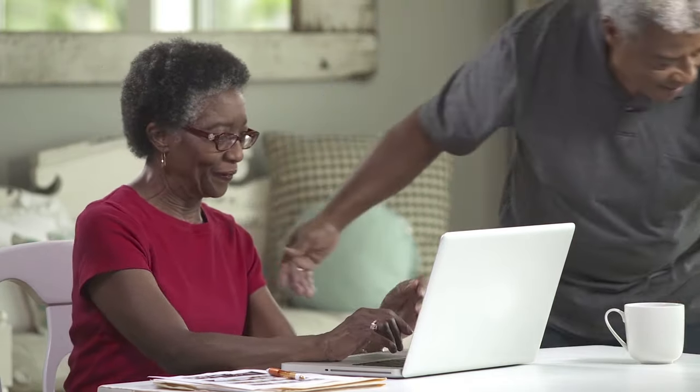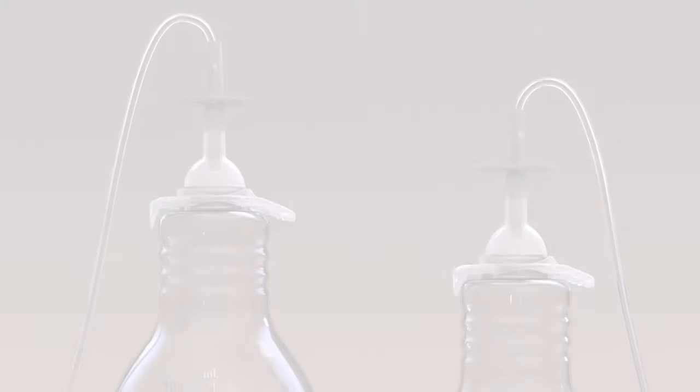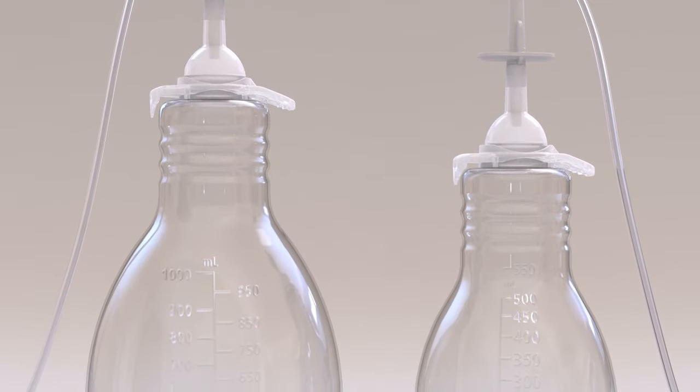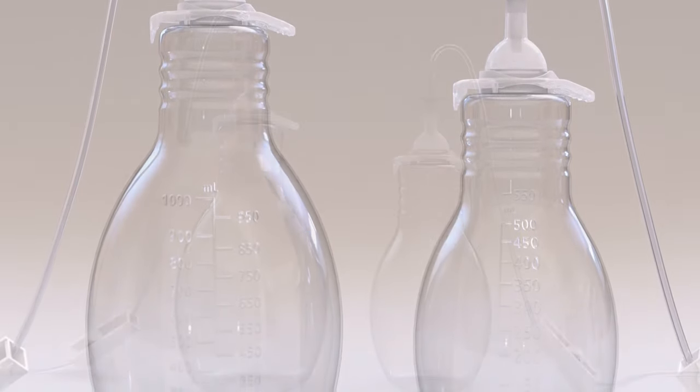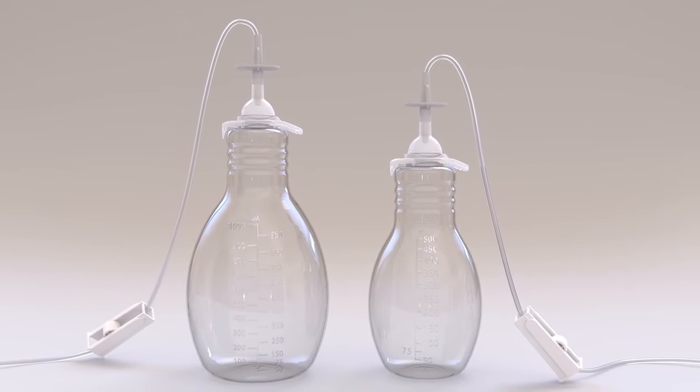Be sure to read the full instructions for use that come with the Plurex drainage kits before you drain. The instructions also include answers to frequently asked questions. If it is an option for you, consider asking a family member or caregiver to learn how to assist you with the procedure — it may be easier with an extra set of hands, although it is not necessary. You should now be ready to drain fluid with the Plurex catheter. Remember to refer to the instructions for use while you are draining to make sure you complete the procedure correctly.